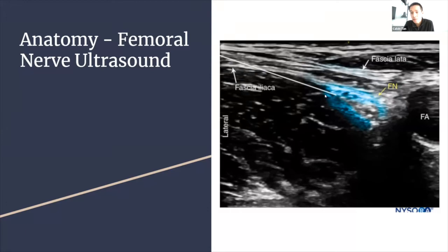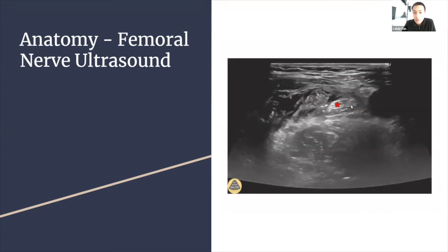So you bring your needle, just like you would any other nerve block under ultrasound guidance, as close as you can to that honeycomb appearing structure. Please try not to stab it. And then when you think you're close enough, you can, again, use the same technique, hydrodissect with about 3 to 5 cc's of fluid. And you should see it wrap around and bathe that nerve, which is illustrated here. So you see that honeycomb structure there.